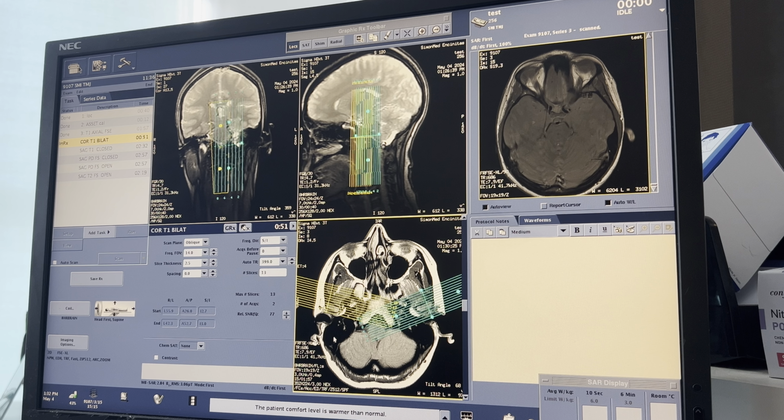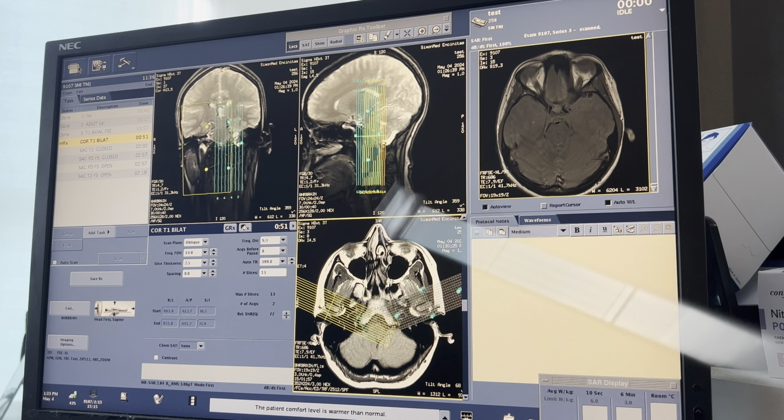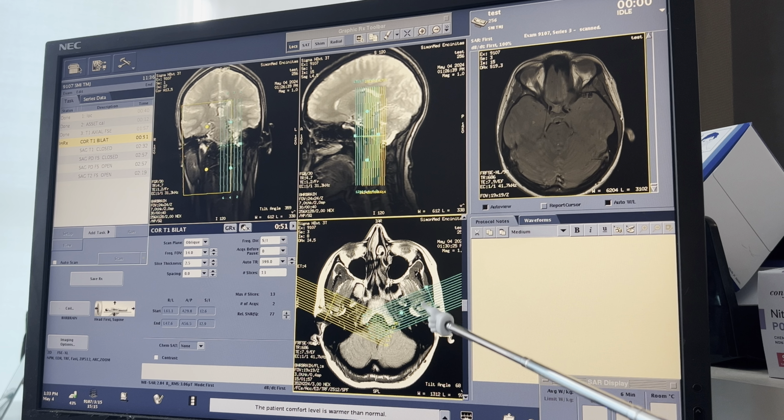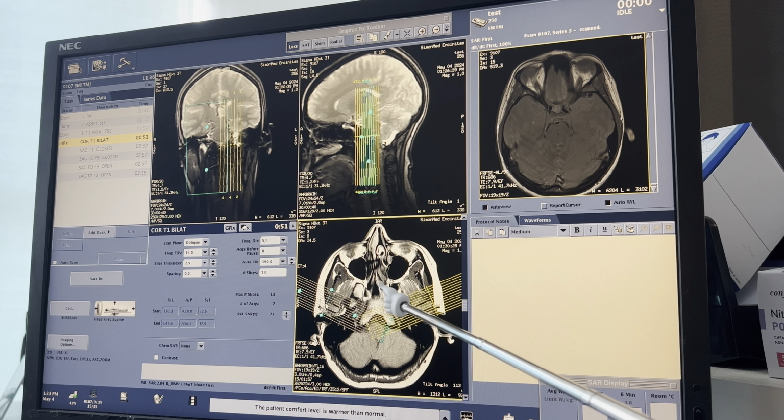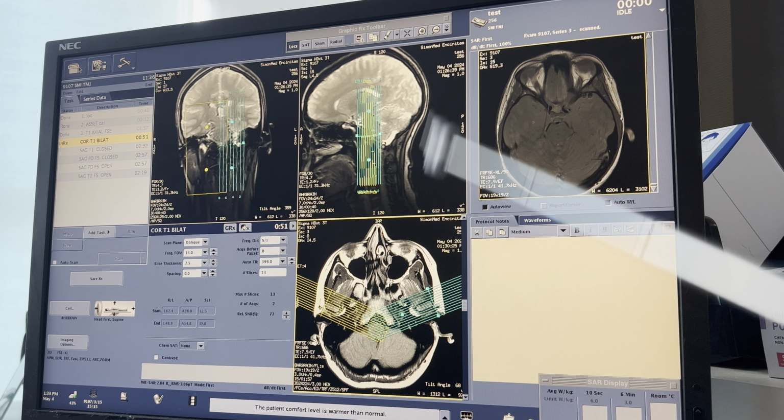Perfect. Yeah, and let's angle the other one and maybe center it a little bit. Perfect. Let's angle it. And this overlap right here in the middle is going to cause crosstalk artifacts, so we want to separate these, we want to spread them out. Yes, exactly, so that reference line is on the outside of the bean. But also, let's kind of center this one, let's bring it down a little bit. Perfect. Same with that one, let's bring it down just a little bit. Perfect. Okay, so these look great.